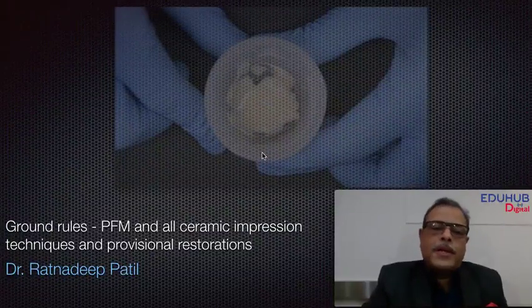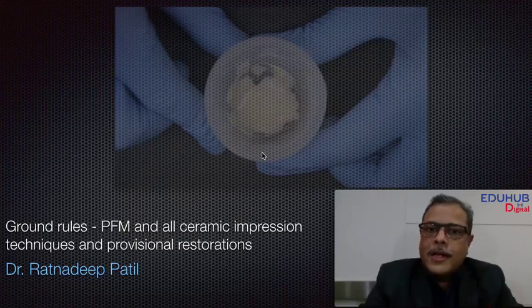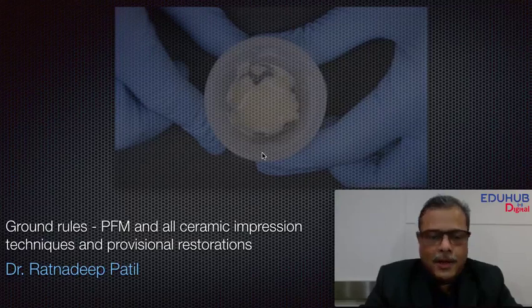After crown preparations, both for PFMs and all ceramic crowns or bridges, the role of the clinician is to make a perfect impression. It could be the conventional impressions, or it could also be the new digital impressions. However, certain concepts have to be cleared.